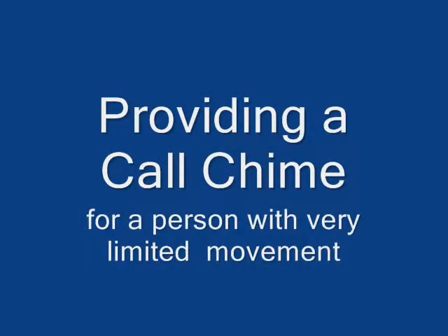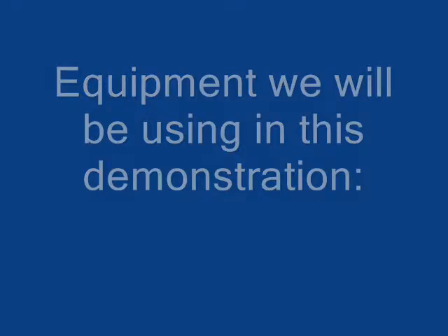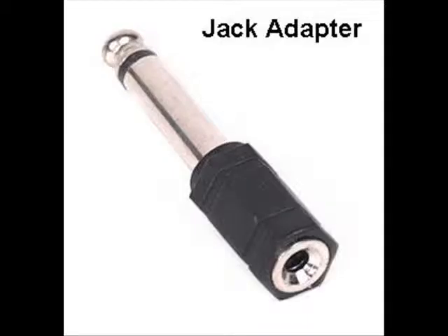How to set up a call chime for someone with very limited movement. The equipment we will be using in this demonstration is all available online and includes a PA-1 call chime, a pillow switch, and a simple Radio Shack adapter.